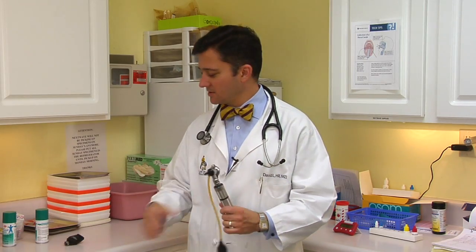So a few of our instruments: the stethoscope, the otoscope, and the ophthalmoscope. Go ahead and, if you can, familiarize your child with these — talk to them. And then when I come in with them, they won't be quite so scared. Talking about the instruments your child's doctor uses, I'm Dr. David Hill.